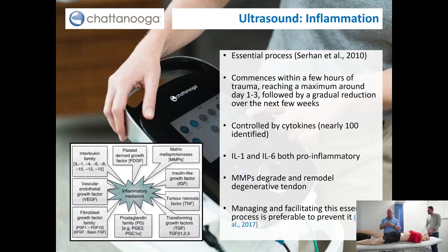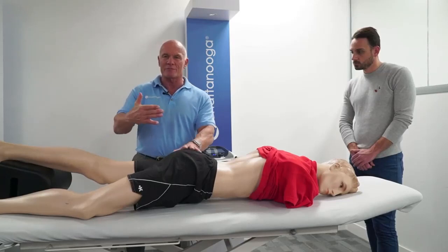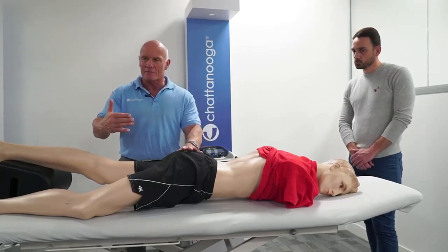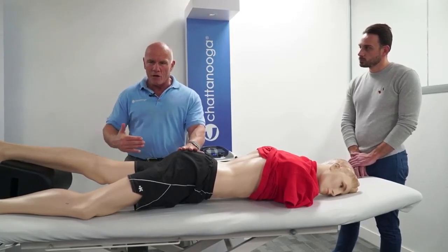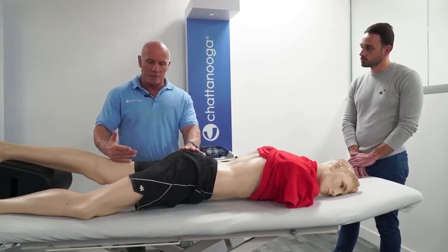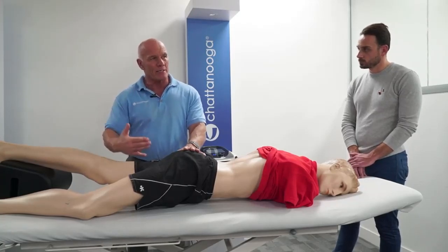So managing and facilitating this essential process is preferable to preventing it. Don't take non-steroidal anti-inflammatories to prevent that in the acute stage, but rather intervene with things like ultrasound, which is considered an inflammatory optimizer. It optimizes the whole thing, and we'll show you how that happens.